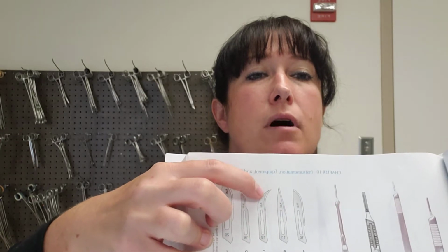It goes off to the side. So that's a number 12. It's not that common. If it's going to be used, it's likely going to be used for tonsillectomy. I've seen it used for other things, but I think that was just a special to the surgeon thing. But anyways, I don't have one of those in the lab.